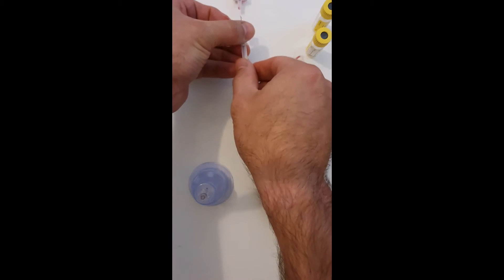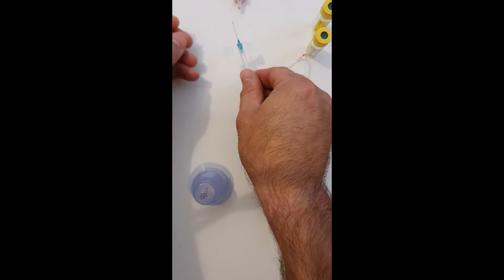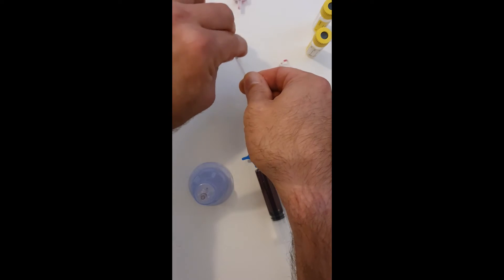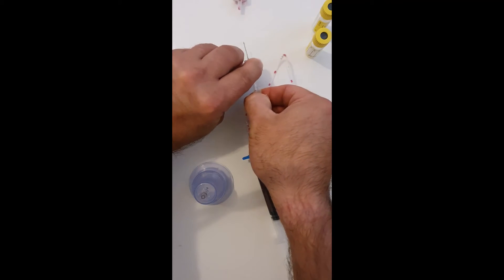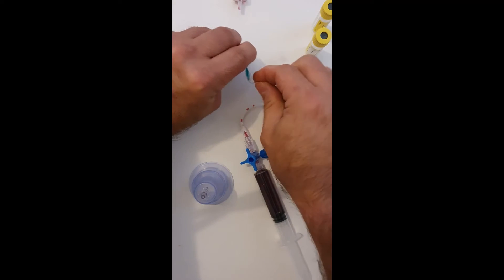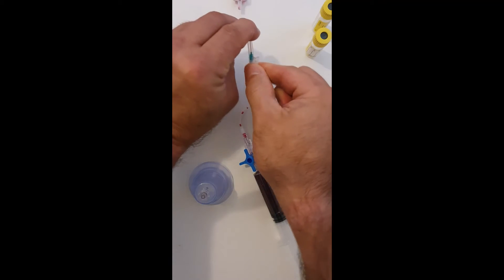And it's at this point, you will see when you remove it from the arm. All you're simply going to do is hold the wings, pull the tube and lock the tube off.